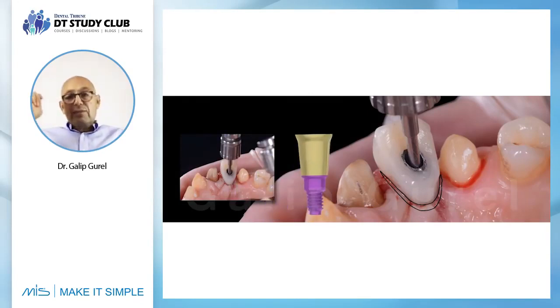If for some reason we wouldn't be able to load the implant immediately, I would still recommend you to use the connect, for the simple reason that you can then have the screw to tighten it up, to seal it, and then place it over the connect and just submerge this under the soft tissue.